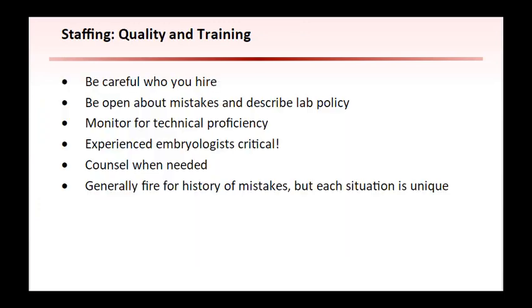The quality of staff is even more critical, as is experience and ongoing training of all staff. Having staff adequately trained and signed off for their proficiency in each and every technique is paramount. The see one, do one, teach one mentality is not an appropriate approach in the IVF lab. Routine assessment of staff to make sure they have not drifted from protocol and monitoring of their performance is also needed.